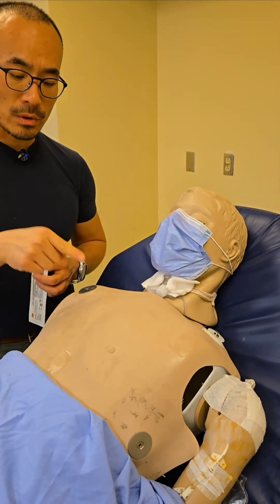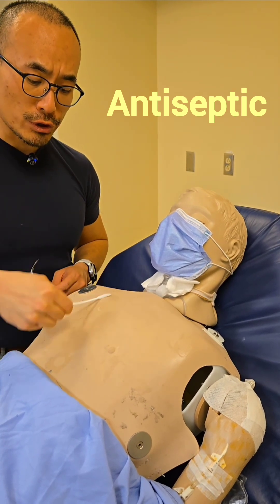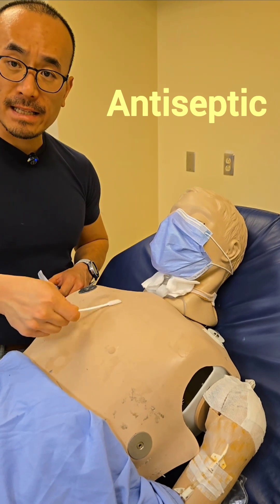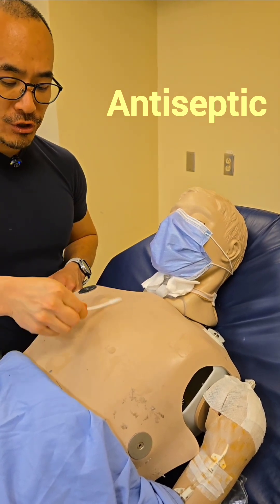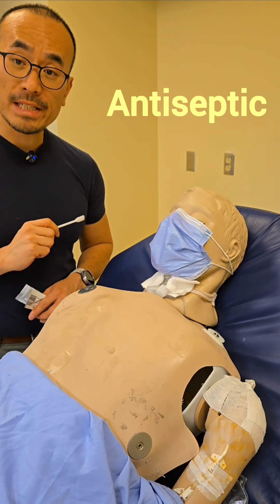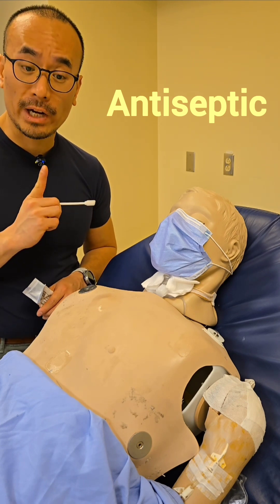Our next step is to clean the site with chlorhexidine. Always follow your institution's policies and procedures, but the rule of thumb is to clean it 15 seconds each way using the hashtag method, making sure you apply good friction. We're going to leave it for about 15 to 30 seconds to clean and also dry — chlorhexidine enhances its ability to kill bacteria when we allow it to dry.